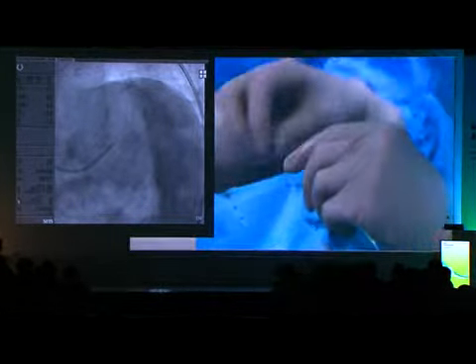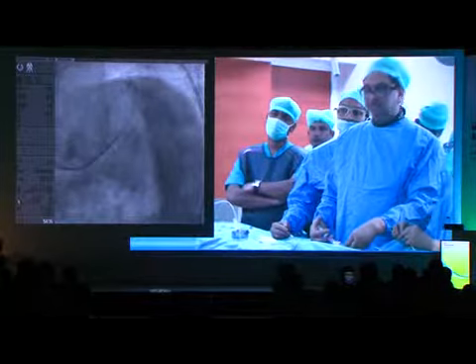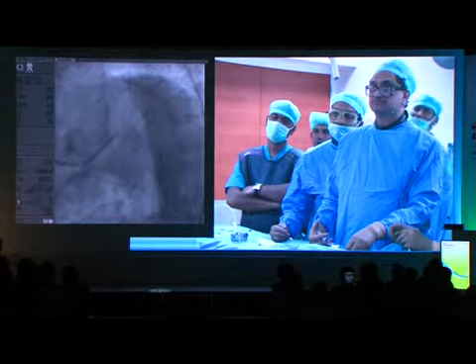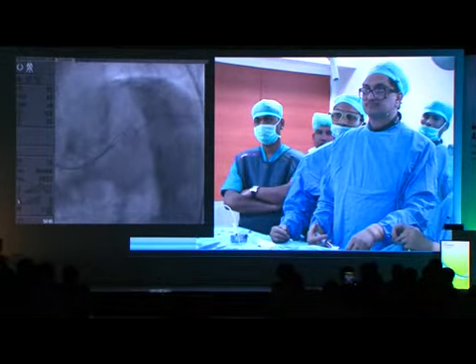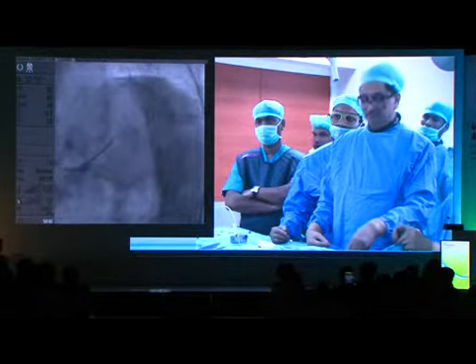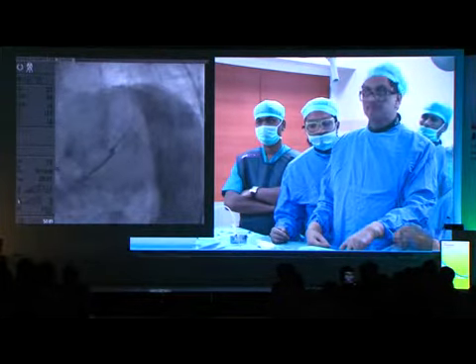One more question. Is there any inhibition for using a 7 French catheter? Because it is involving the ostium of the LAD, and if the ramus gets pinched and you have to do a simultaneous balloon dilatation, 7 French would have been better, or the support provided by the 7 French would be better? Personally, I use 6 French most of the time, and we can do nearly everything like that, even bifurcation, even left main.